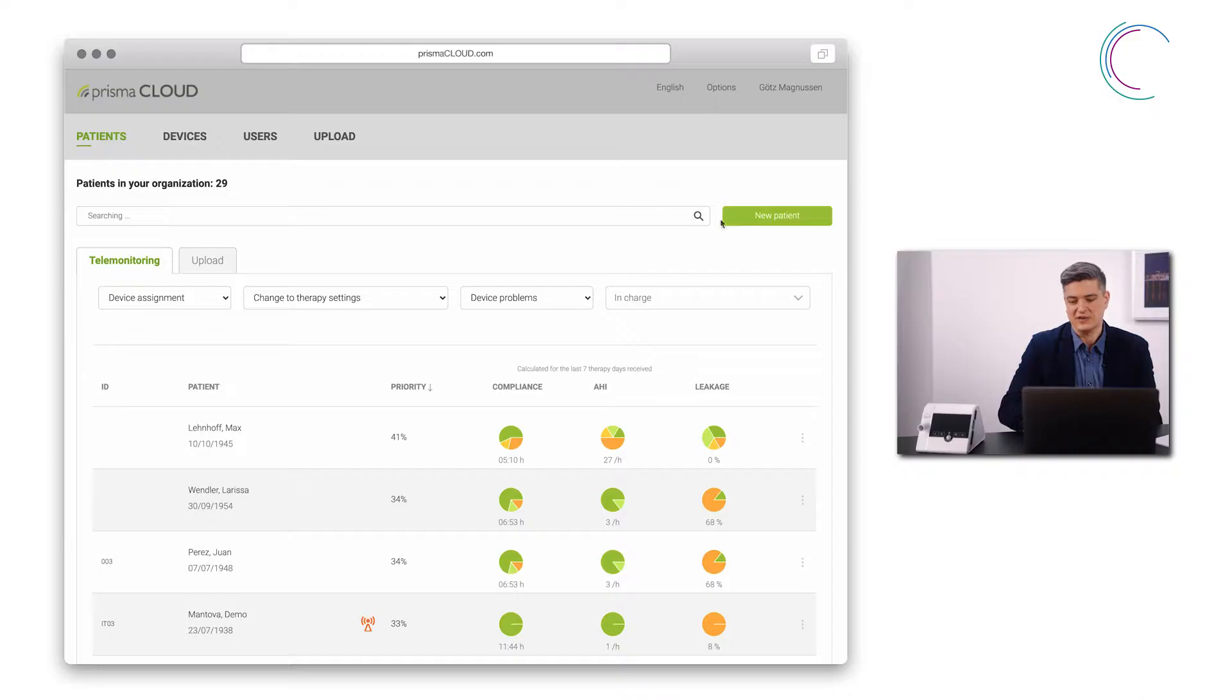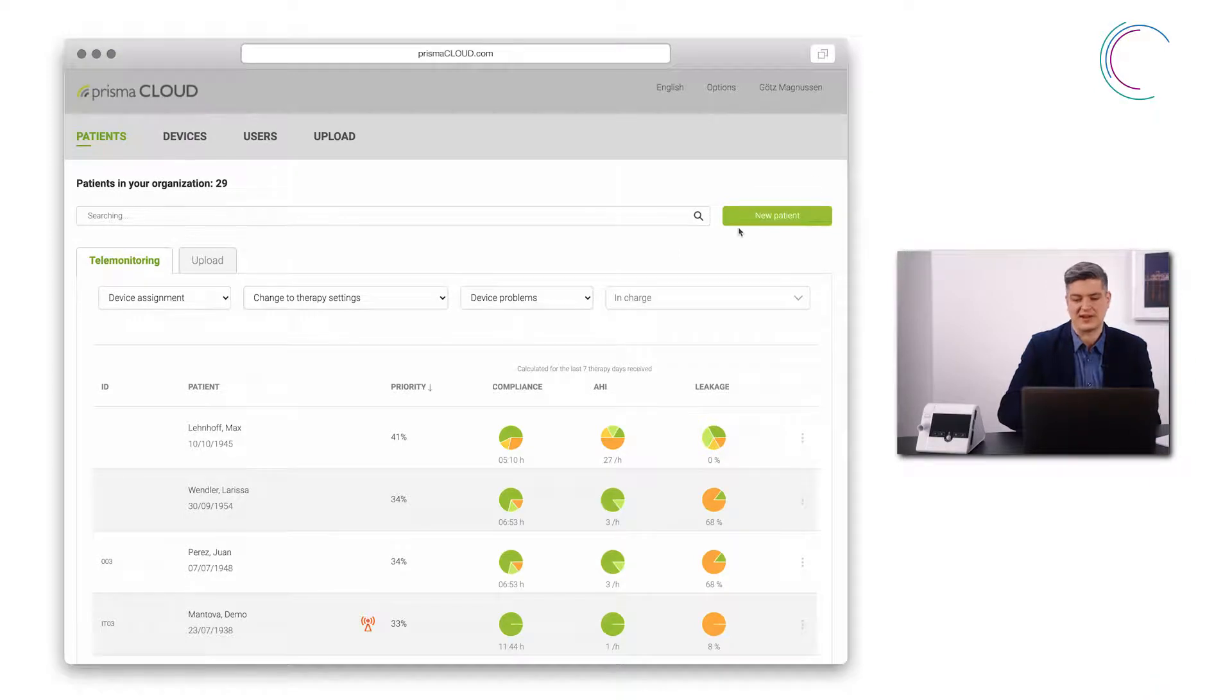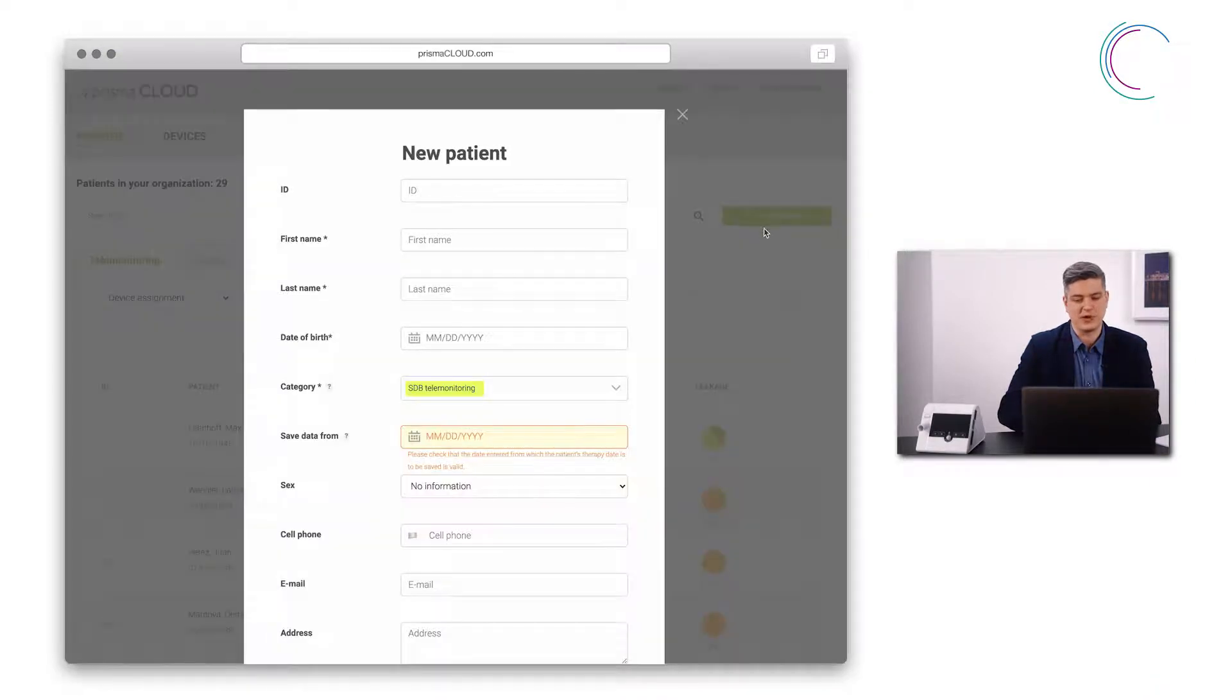To create a new patient in Prisma Cloud I can proceed as follows. I click on new patient on the upper right side of the dashboard and this window opens.